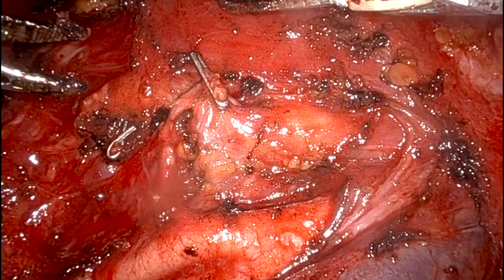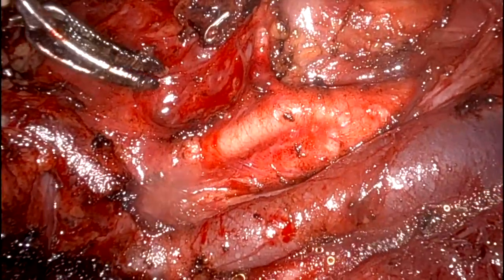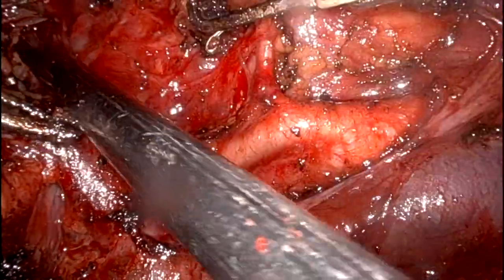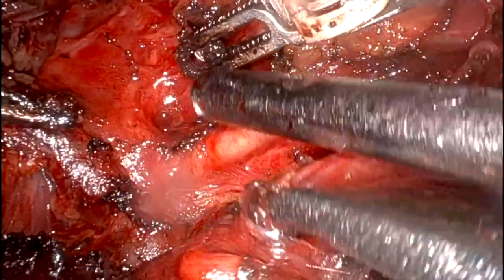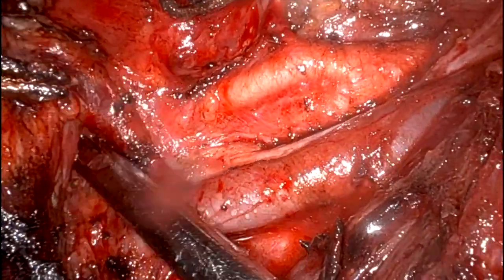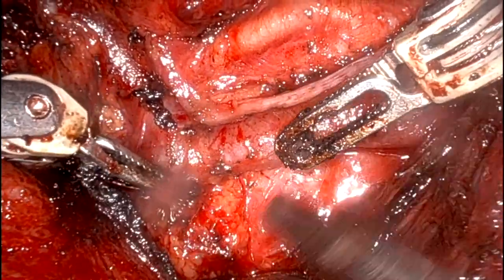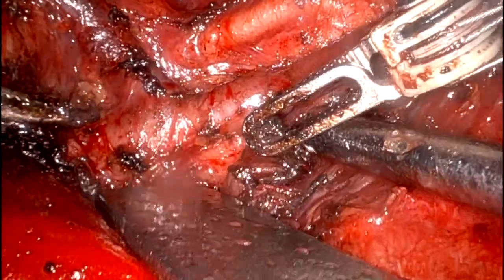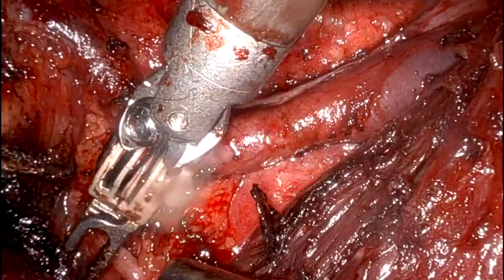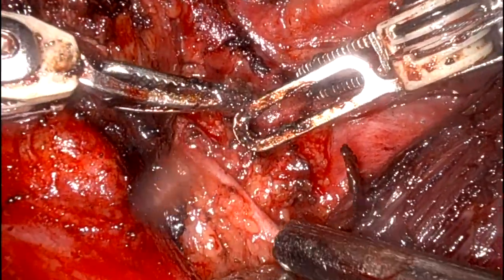Still, we have not seen the hypoglossal nerve. Now we will go for level 2B. For this, we changed our retractor and took my camera back. So this suction is pointing towards the digastric muscle. This is the spinal accessory nerve. This one. More camera back.